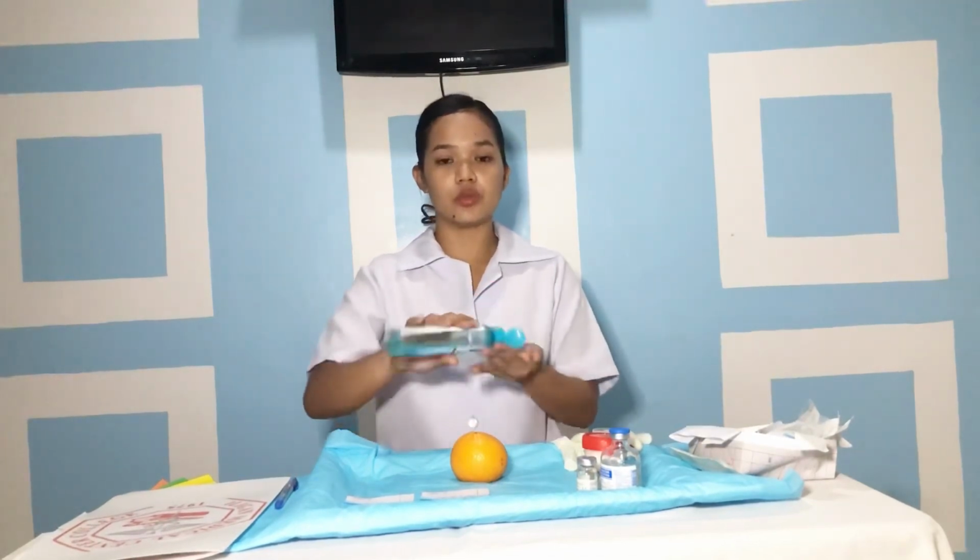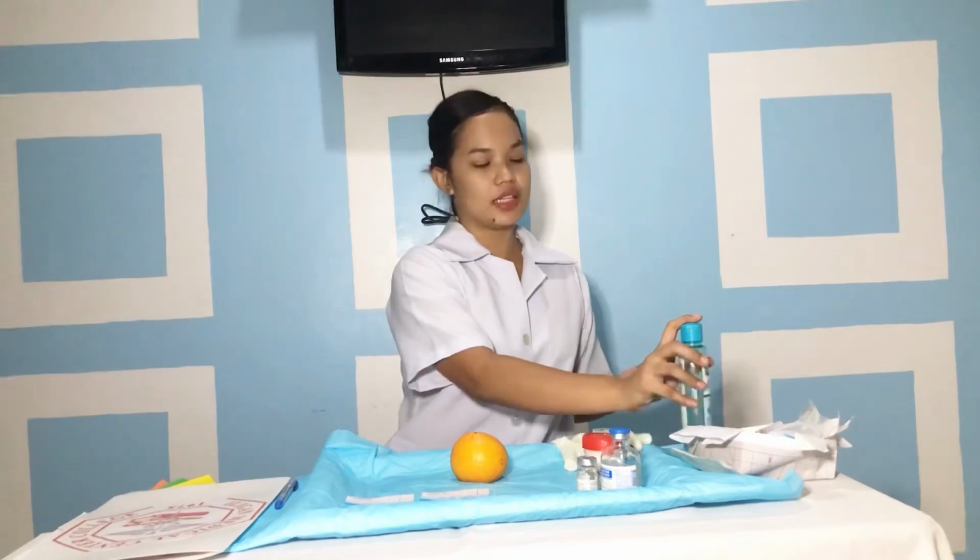And then we discard the needle, as what you have seen, with the syringe into the puncture-proof or leak-proof receptacle. So this proper needle disposal prevents needle stick injuries. And then again, we perform hand hygiene. So this will reduce transmission of microorganisms.